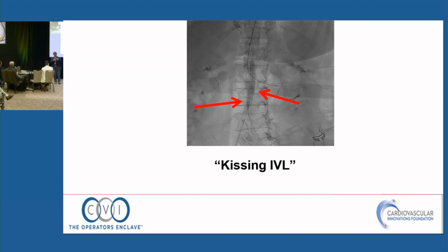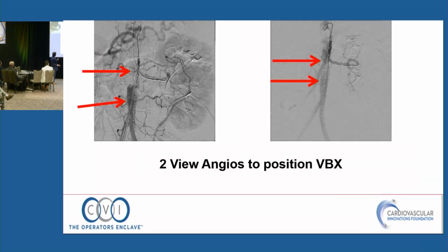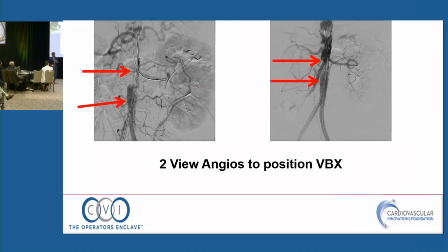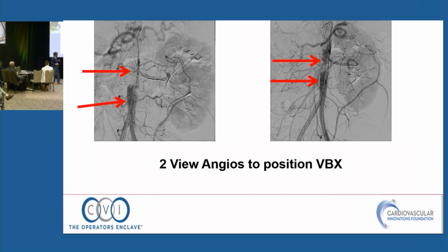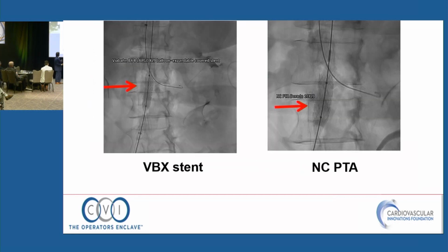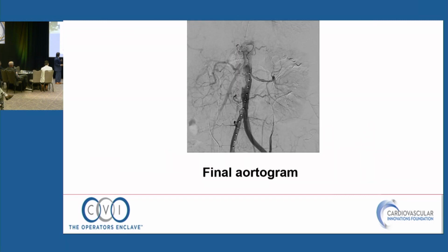So back then this is kissing shock wave, so you offset the emitters here, okay? And then now you see a nice luminal expansion. And then, as mentioned earlier, we're going to put a covered stent graft here, so we've still got the wire protection here. We very carefully position between the IMA and the renal artery, guided by the ultrasound, guided by everything else. Put that in there, and then did post-dilatation. And nice final safe result.